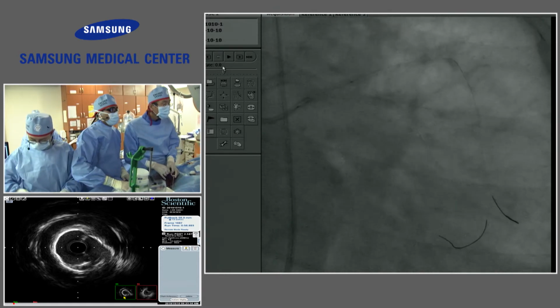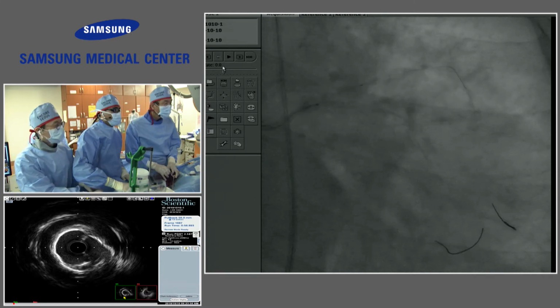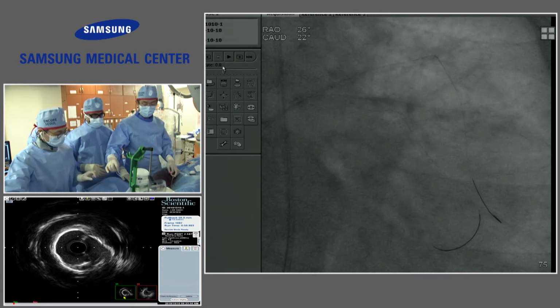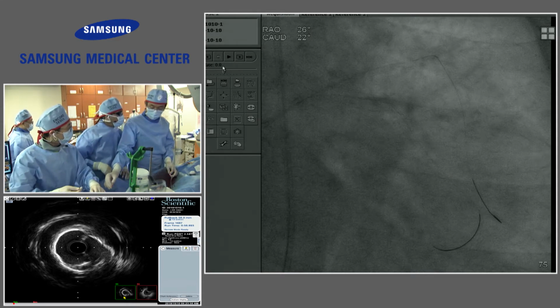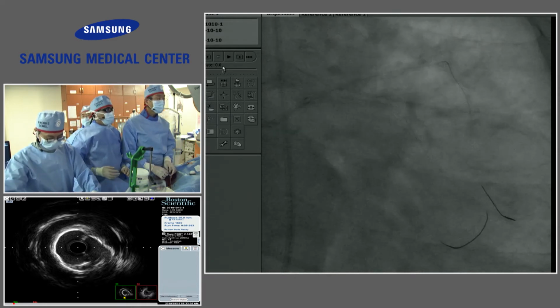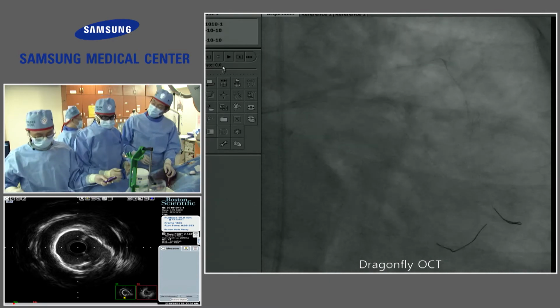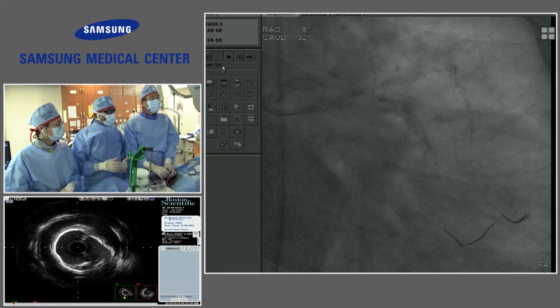It's hard to say. Resistance. Okay, it's not going. It's not prolapsing. So we're going to have to dilate this. A 3.0 balloon. Still, I didn't decide rotablation or not. We can do a gentle predilatation. OCT first? We need to dilate before we can get the OCT down. It won't go. It's too tight.